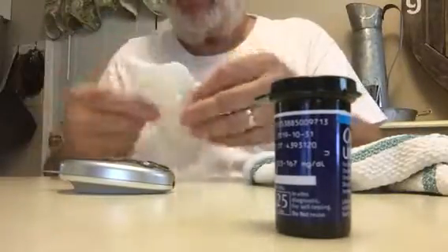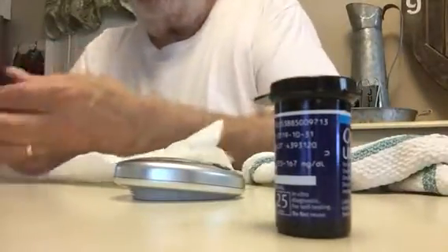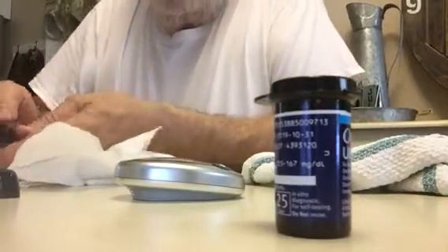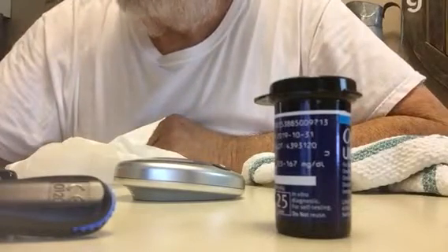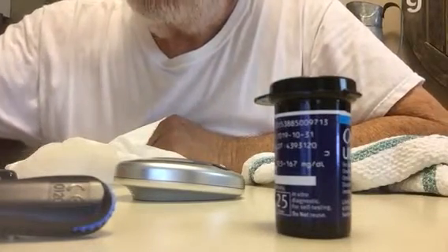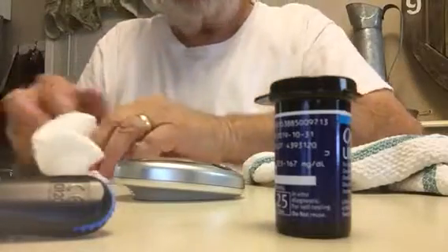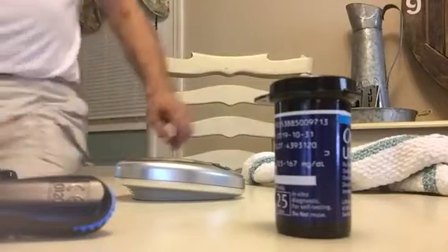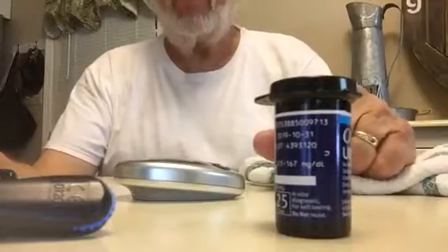With a paper towel I take out my used lancet and remove it. There's a way to stick these little needles back into the plastic so they don't hurt anybody. Then I just wrap those up and into the trash can. That's it — simple.